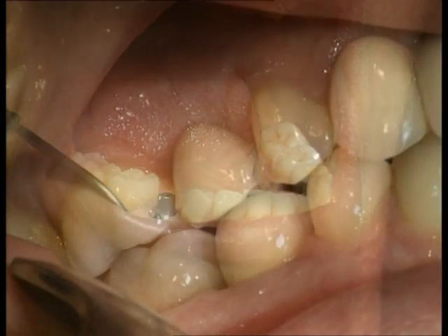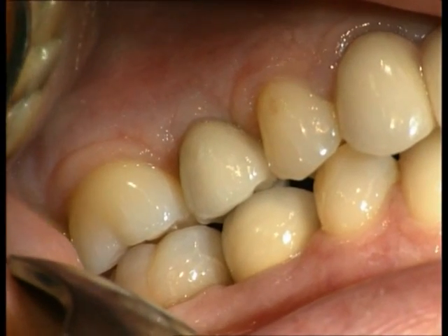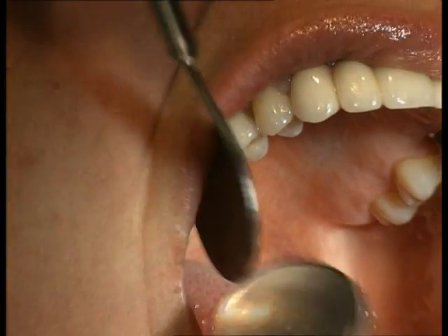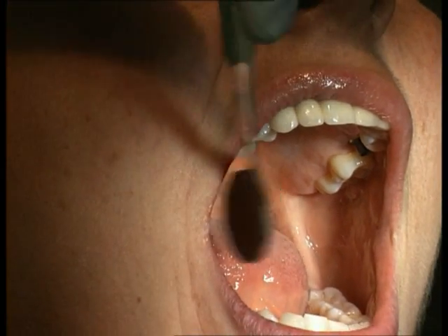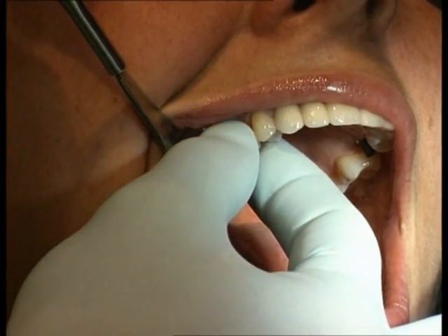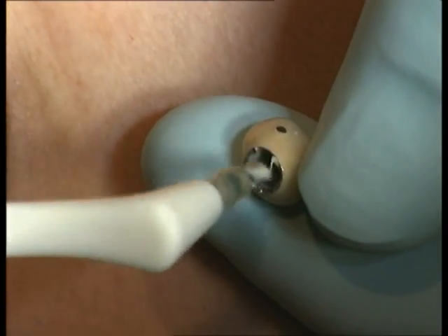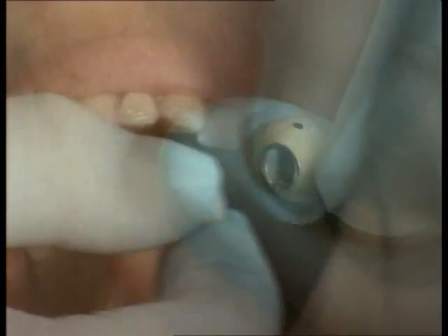Now the restoration is ready for trial insertion in order to check for proper occlusion and articulation. If necessary, any occlusal corrections are made, followed by final polishing. A glass ionomer cement or zinc phosphate cement is used for final cementing.